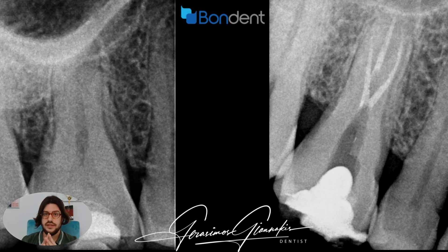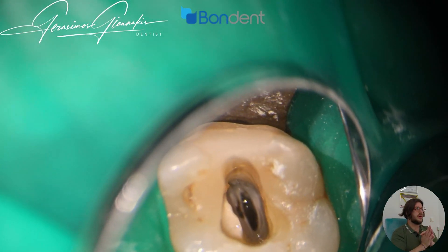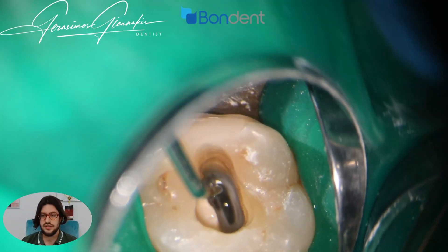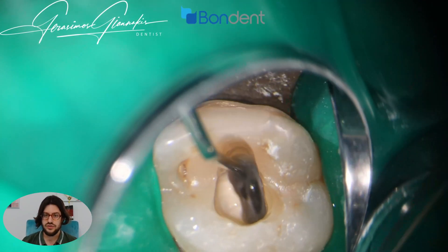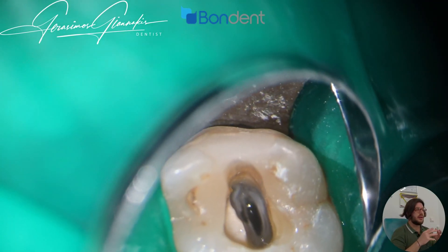First of all, we need to understand and evaluate the clinical scenario. In this case, we can see the outline of the buccal roots, but unfortunately not the canals. As you can see in the video, even under magnification from the microscope, I can only see the oval shape of the pulp chamber.